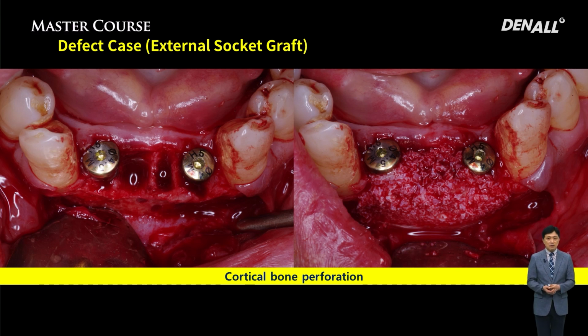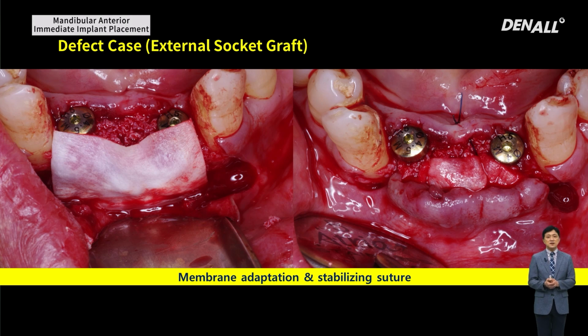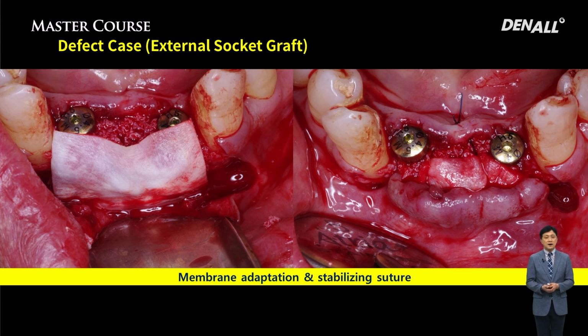before the bone graft procedure, considering the bone regeneration volume. And the membrane should be used. In this case, bone tack or screw can be used to fix the membrane, but membrane stabilization methods, including membrane suture, need to be used to stabilize the membrane. That's what I want to say here.